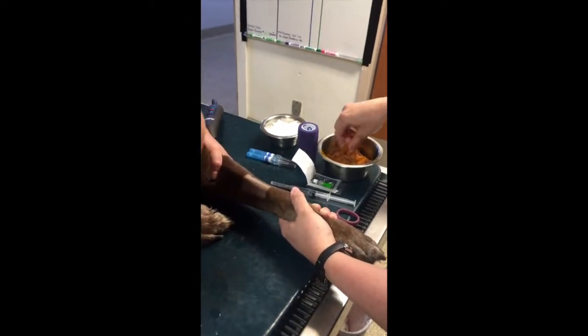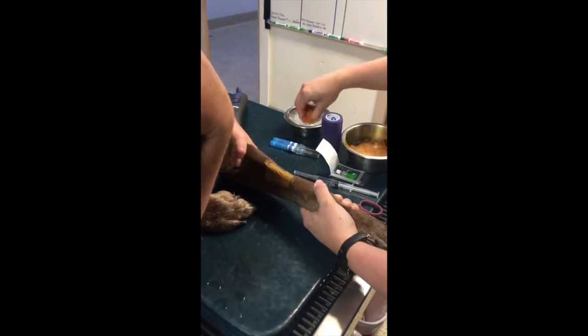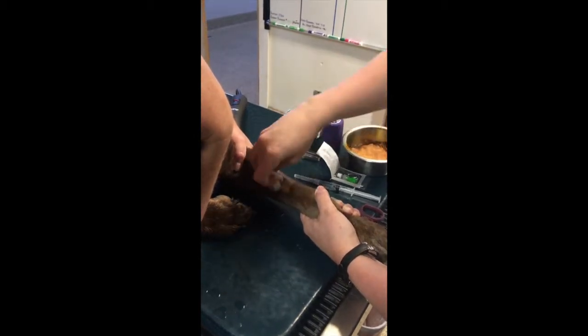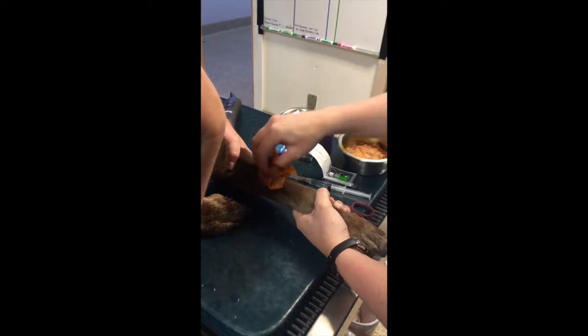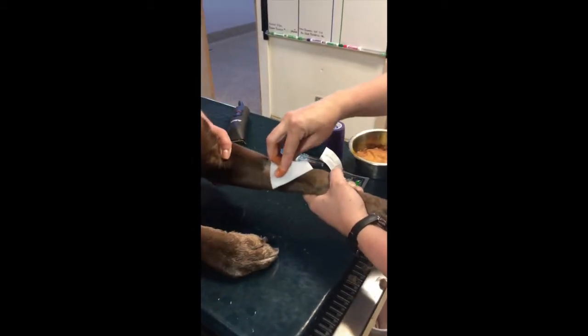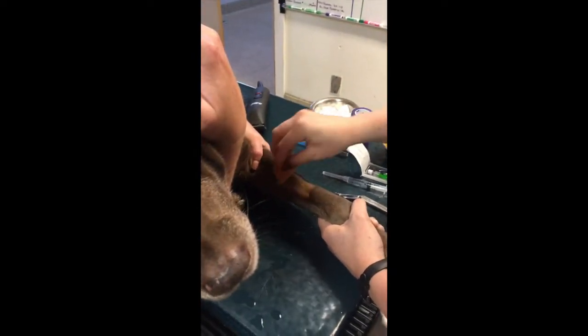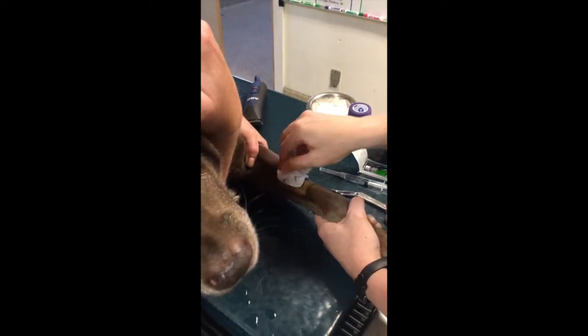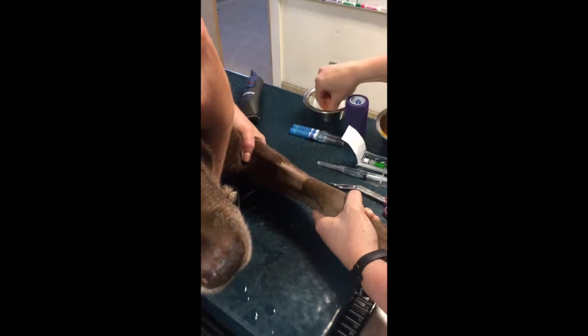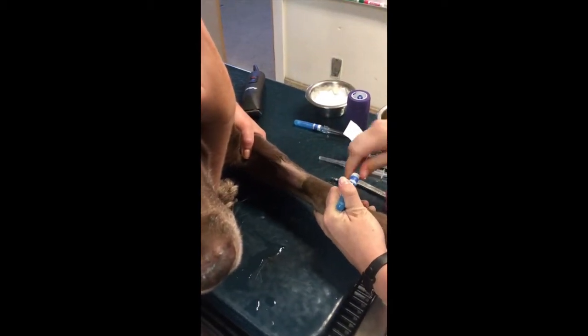So I have a betadine and alcohol scrub. So I'm going to take 3 betadines. And then rinse with alcohol. Alright, then I'll do one final alcohol. Alright, once I have that nice and scrubbed, I'm going to go ahead and uncap my catheter. Get that ready.